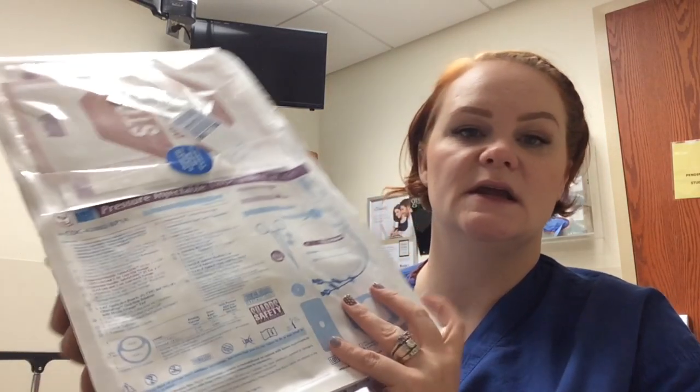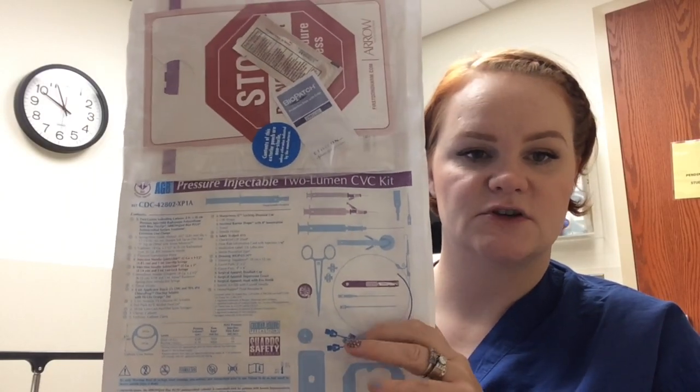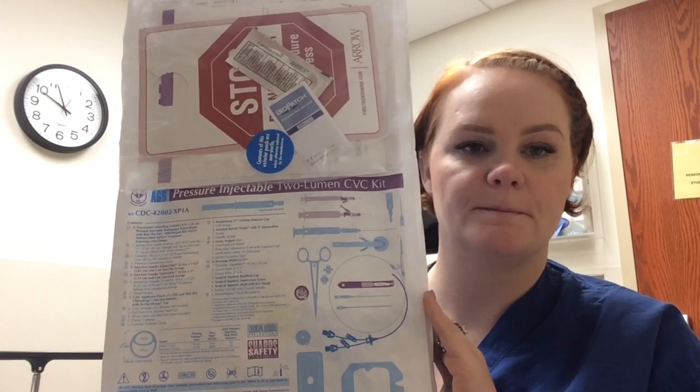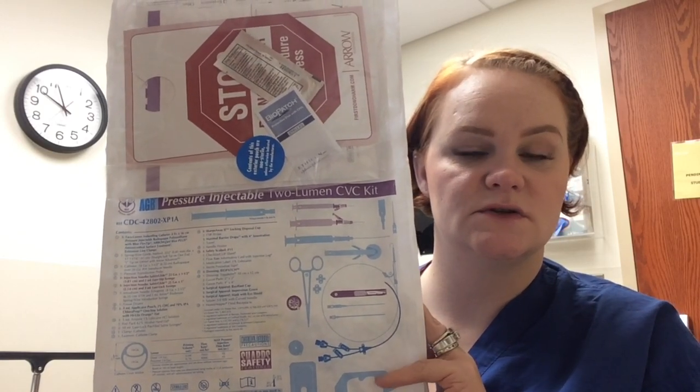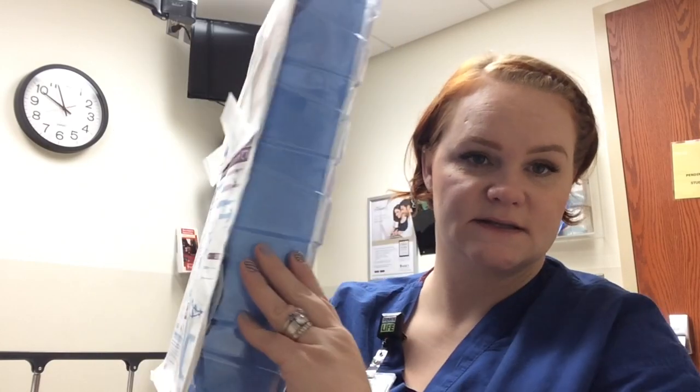If the physician just wants to put a triple lumen in or a double lumen, the kits look like this. The triple obviously would have three pieces hanging off, and then this is the double. It's got everything they need to place it within this nice package.